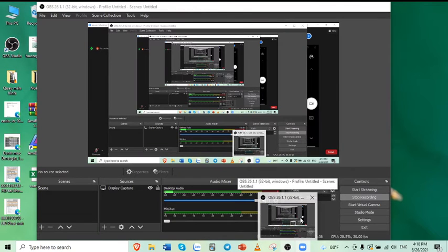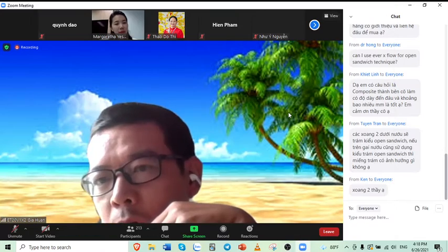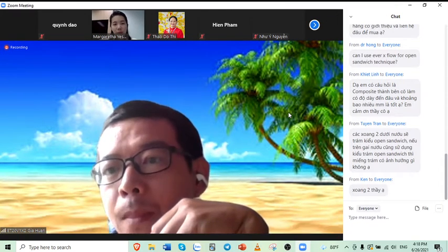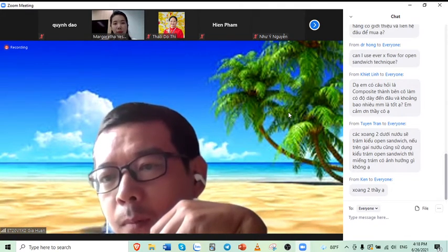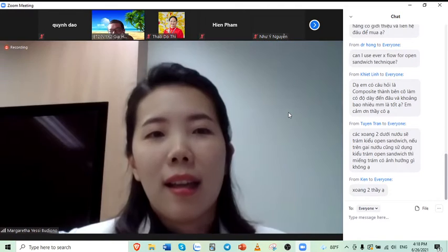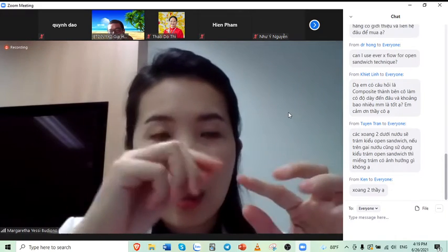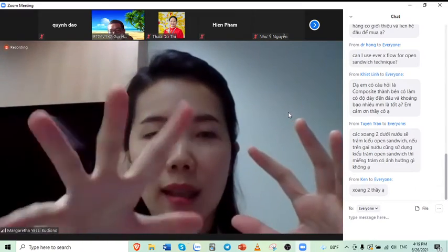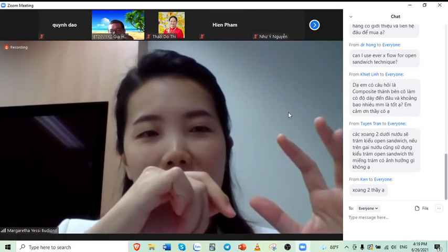The question is: with a small cavity, when you fill it with the glass hybrid, will you put the coating agent before or after we adjust the occlusion? Okay. The final coat is meant to be a protective layer. So once we adjust the occlusion, then we can apply the coat straight away.